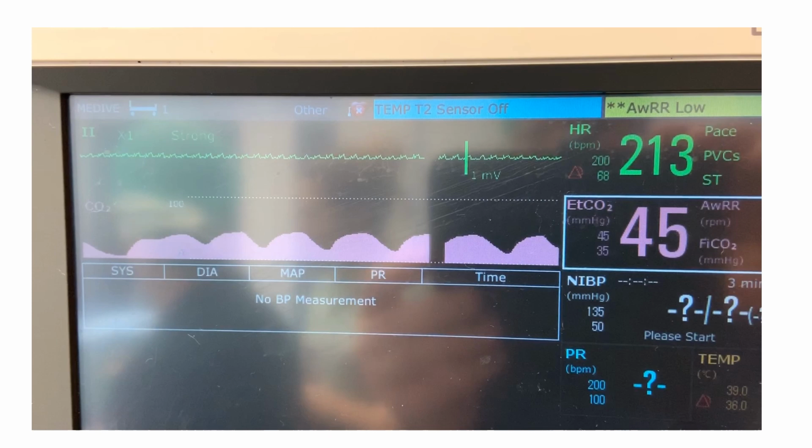When we ventilate for that patient and help it, then it's clearing all the CO2 out of its system. So what we were doing here is, rather than taking over the breathing completely for the patient, we were just helping it along with a breath every now and then, and that was keeping the CO2 at an appropriate level. What you're looking for there in millimeters of mercury is a number between around about 35 and 45. And what we were finding was that frequency of ventilation was absolutely fine. If the numbers had kept on climbing from there, then we would have increased the frequency of ventilation and brought those numbers back down again.